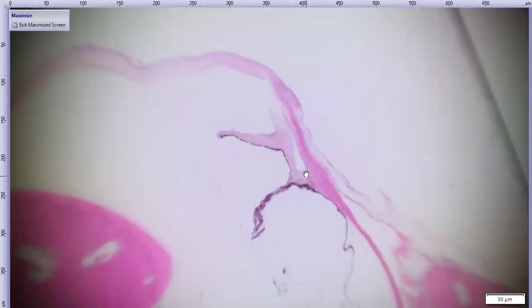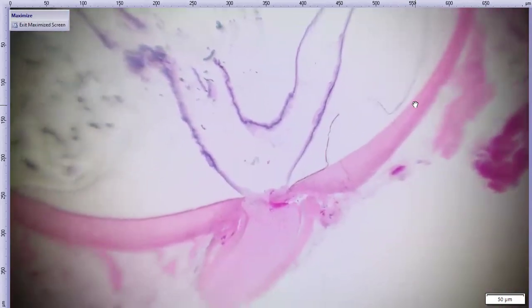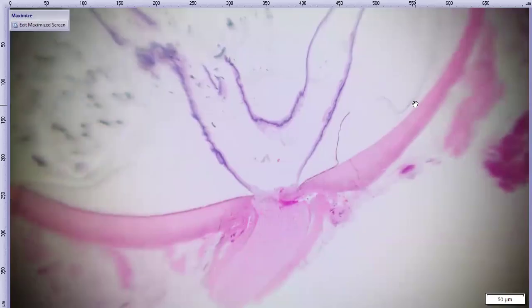We have what looks like ciliary body down here, or maybe base of iris. The limbus maybe starts way up here. You can see conjunctival fornix way up here. So essentially, we have a really deep anterior chamber because of distortion of the anterior uvea. We'll take a subgross view of the optic nerve, and it's not really remarkable from back here. So we'll take a closer look as we put this up here.